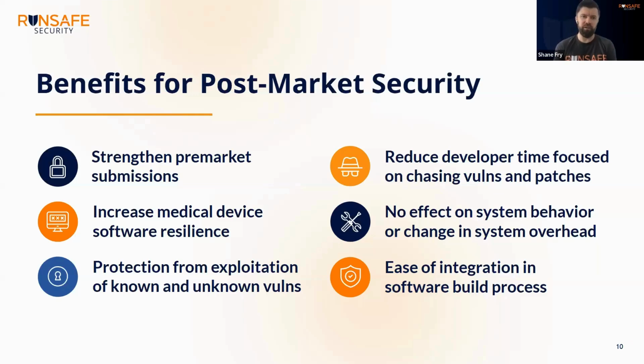Go look at your frameworks for looking at whole classes of vulnerabilities. What can you take away? If it's an embedded device where you've got a lot of compiled code, look for ways that you can mitigate whole swaths of those vulnerabilities. Playing whack-a-mole is terrible. I found vulnerabilities for the majority of my career, it's tough, and patching them is even harder. So, finding ways to categorically eliminate threats is going to pay off way more dividends than you getting really good at fixing critical vulnerabilities one by one.